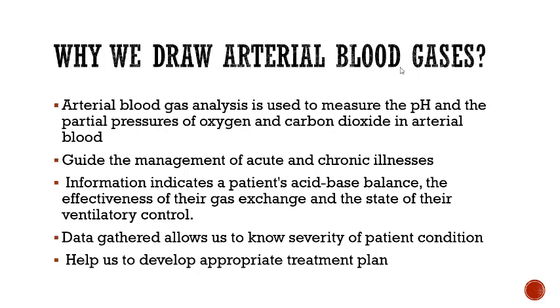Now, this tells us a ton of information about disease process, how to treat a patient, interventions that we should be doing, changes that we should be making. It's a big diagnostic test that we do very, very frequently. You guys will see them in clinical quite often.